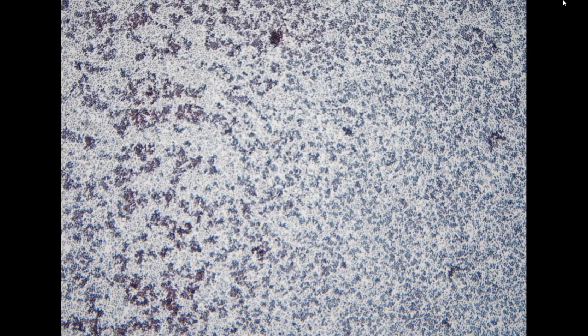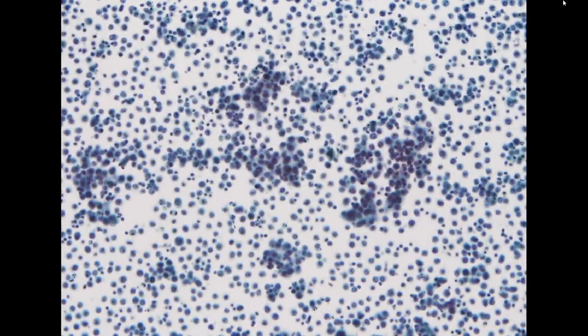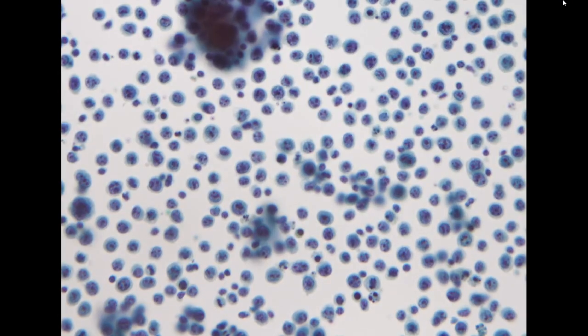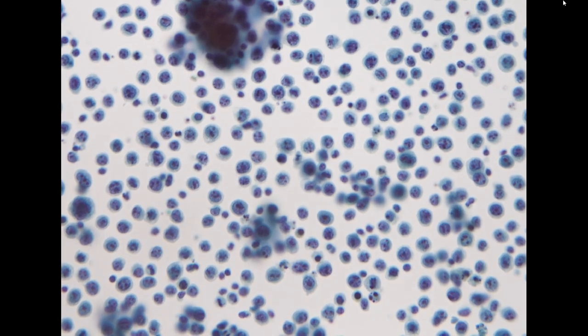The next specimen, we've seen a specimen from the same patient last week. This is a 68-year-old male. He had a prior history of lung cancer. And the last specimen we saw is a pleural effusion specimen, and this is an ascites specimen. Last time, we initially suspected it was a recurrence of lung adenocarcinoma with poor differentiation. However, it turned out to be primary effusion lymphoma, which is positive for HHV8.